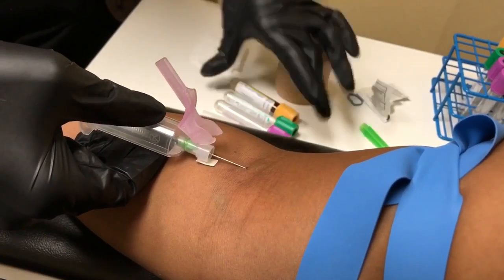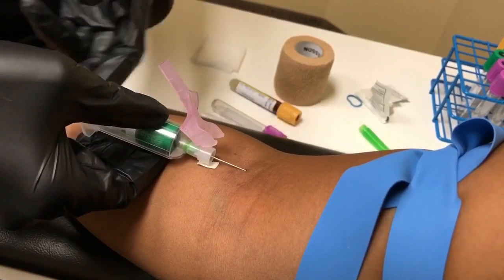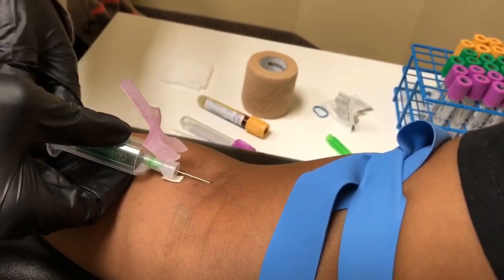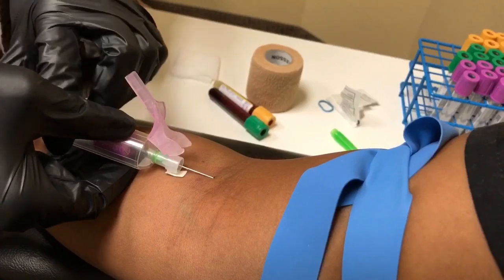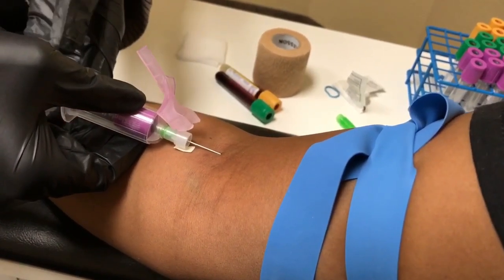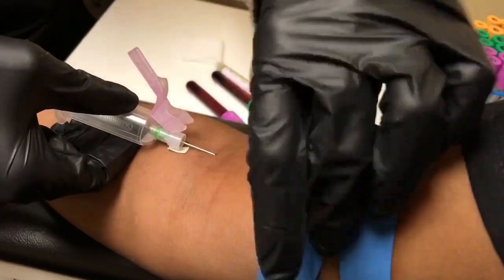You always want to invert your tubes after you draw them. I'm not going to fill this whole tube. Invert. You'll notice that I'm keeping the needle really steady. You want to apply a lot of pressure onto the arm so that you're not moving the needle around. And that's all of them.